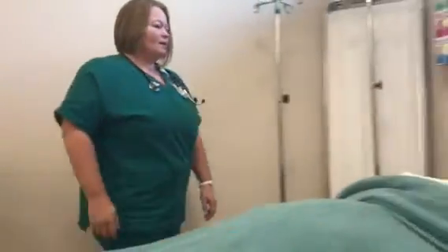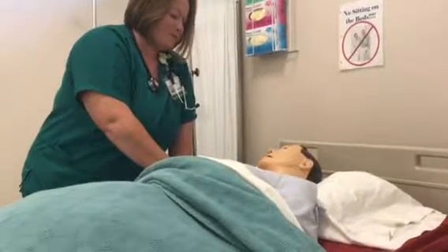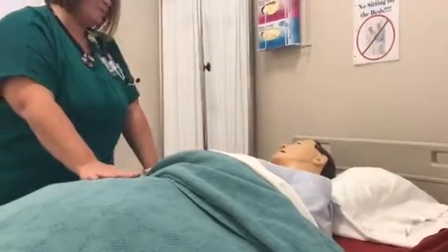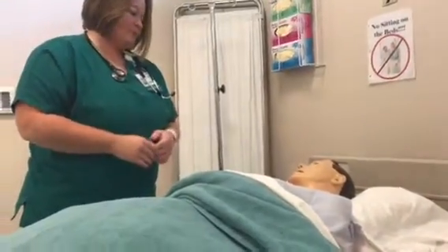Okay. Hello, my name is Tracy. I'm going to be your nurse today. Can you tell me your full name and date of birth? Good. I came in, we're going to be doing some enteral nutrition with the tube that's in your stomach. Would that be okay? Do you have any questions? No? Okay. I'll walk you through the steps as I'm going so you're familiar with what I'm doing, okay?